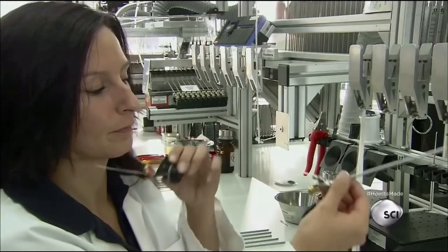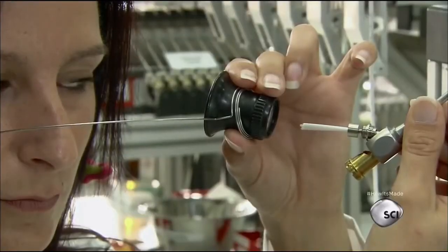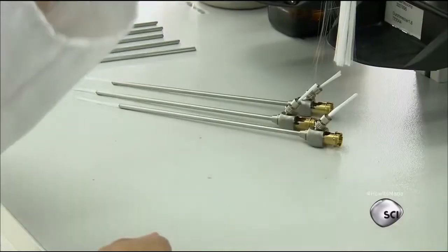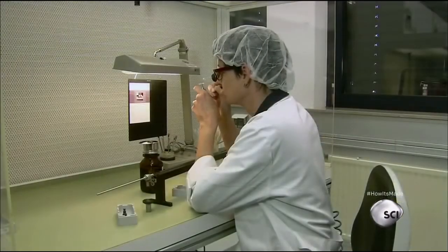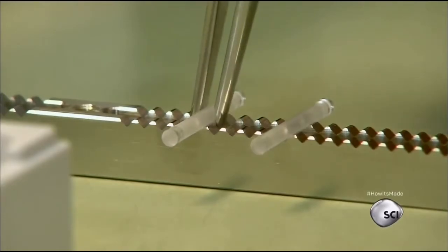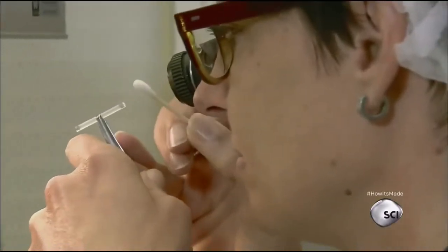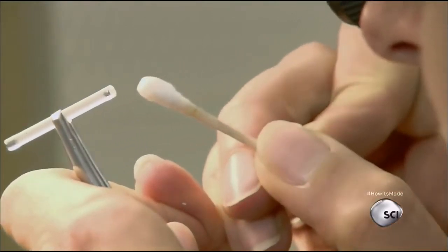A worker inspects those fibers under magnification for black spots. Black spots indicate broken fibers, which would interrupt the transmission of light. An endoscope transmits an image much like a telescope does. Optical lenses send reflected light which produces the image from inside the patient all the way up to your eye peering through the top.